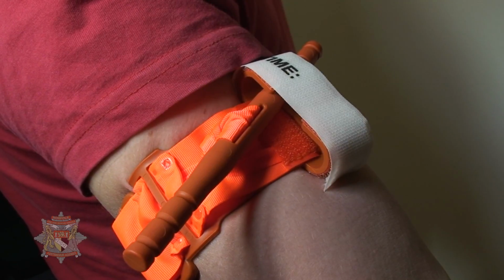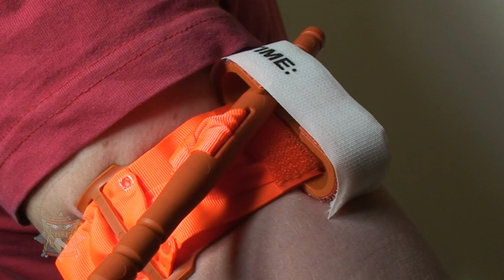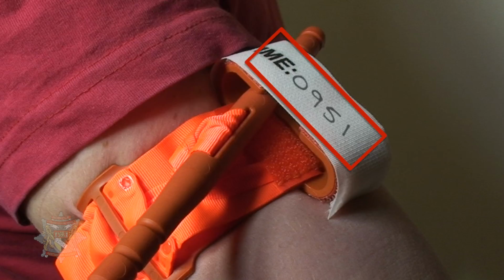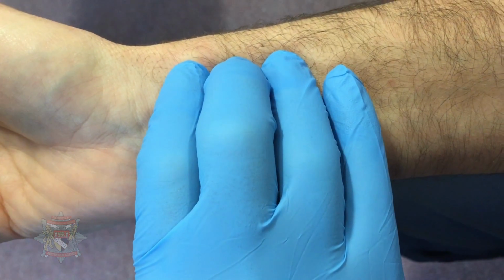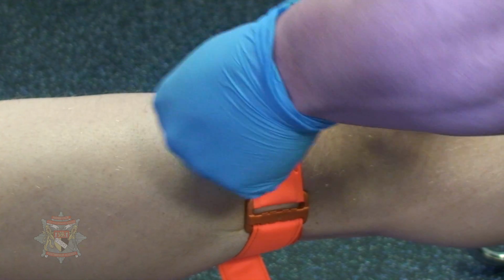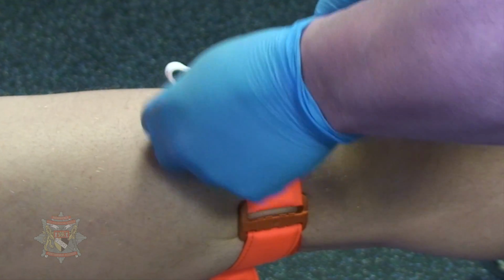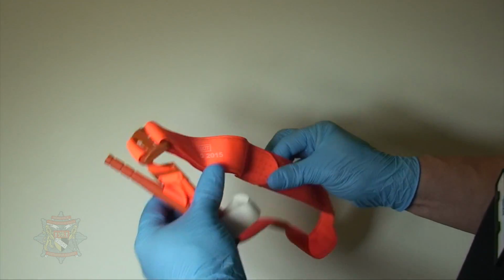Ongoing treatment will vary depending on how long the blood flow has been occluded. It is therefore crucial to record the time of application on the tab so that receiving medical staff can treat appropriately. Monitor the patient closely. Do not remove the tourniquet. In the unlikely event that the bleeding is not controlled, consider additional tightening, and if available, a second tourniquet can be applied beside the first.